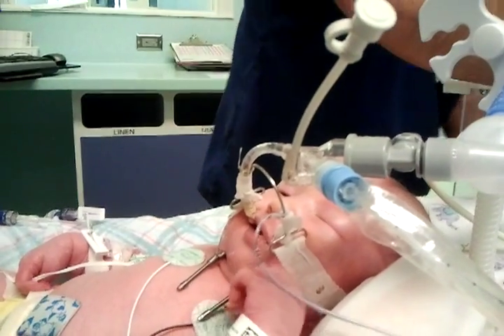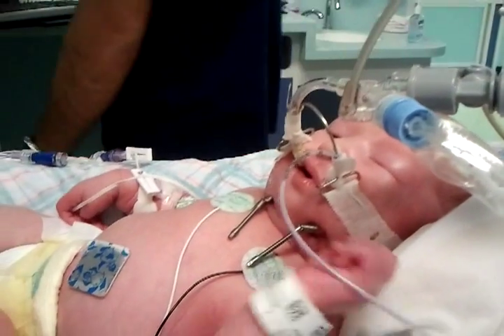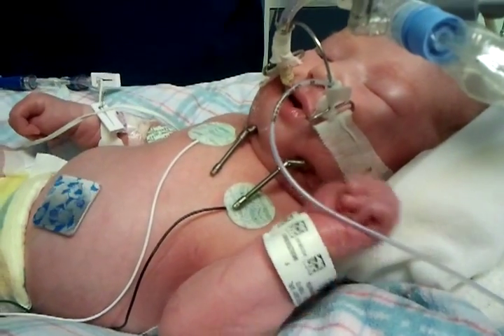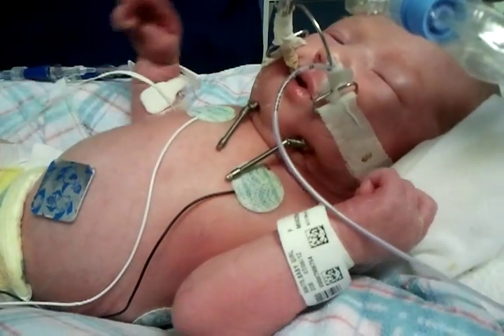And that's it — it just moves them. One turn equals half a millimeter, so it just kind of moves her jaw just that much. It can hurt; it can be a painful procedure. At this point we don't know, because we've had good pain control.